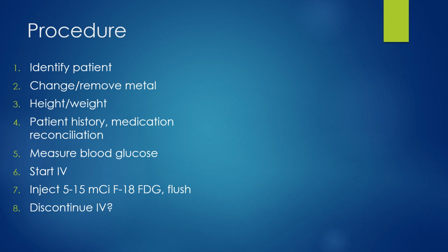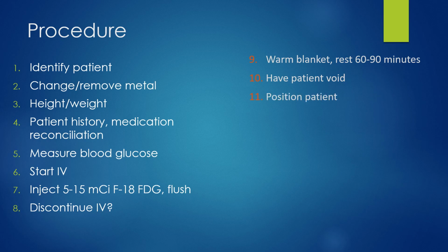Now, you could discontinue the IV here. Some facilities want you to keep it, especially in diabetic patients, just in case they need something else. And if you're doing diagnostic CTs with contrast, you want to leave the IV in. Give the patient a warm blanket, have them rest for 60 to 90 minutes. At the end of that uptake time, you'll have them use the restroom, bring them back to the scanner and position them supine.